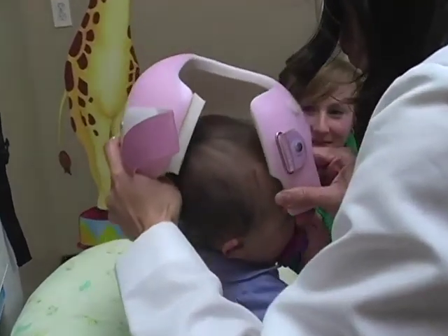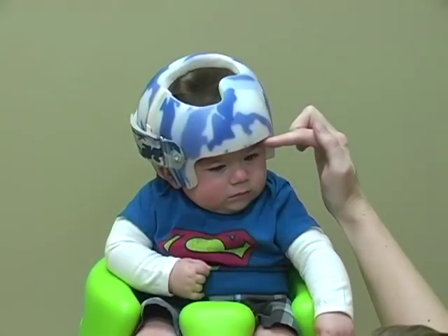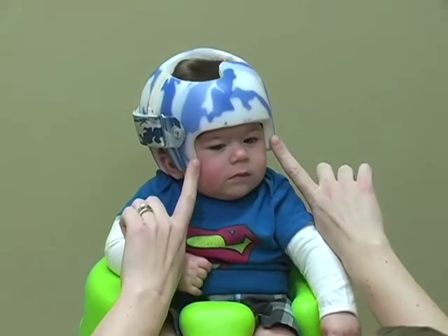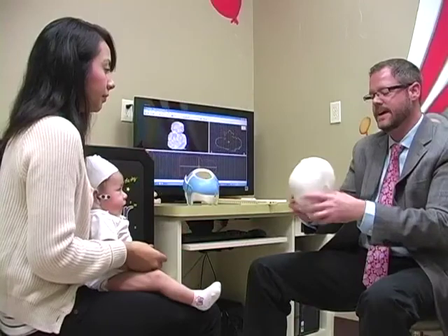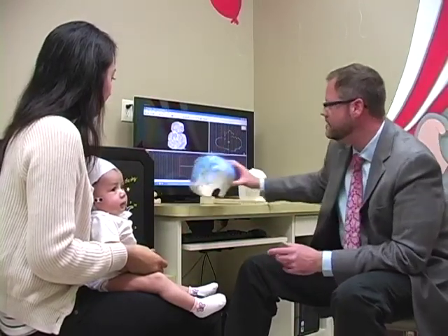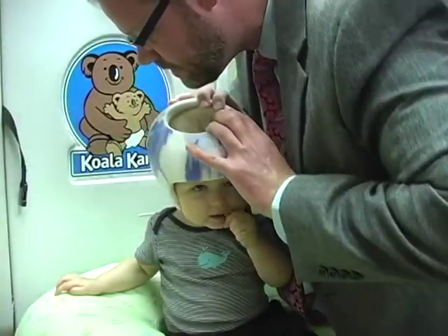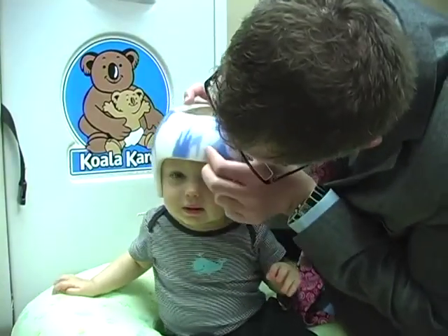The Starband orthosis is fit approximately 8 to 10 days after the scan to order appointment. It is important that the Starband is fit in a timely manner after the scan to order as the head continues to grow. If too much time lapses between the scan and the fitting of the Starband, there may be significant alterations that will need to be done to properly fit, and a good clinical outcome may be compromised. The fitting appointment lasts approximately 1 to 1.5 hours to complete any needed adjustments to the fit and to spend time educating the family as to proper wear and care techniques.